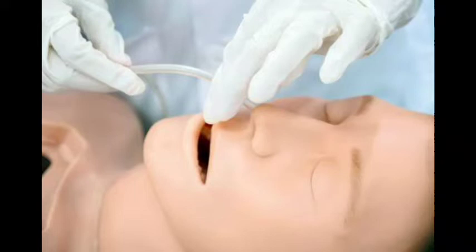Once the tube reaches the oropharynx, the client will feel the tube in the throat and may gag and retch. Ask the client to tilt the head forward and encourage the client to drink and swallow. If the client gags, stop pausing the tube momentarily. Have the client rest, take a few breaths, and take sips of water to calm the gag reflex.